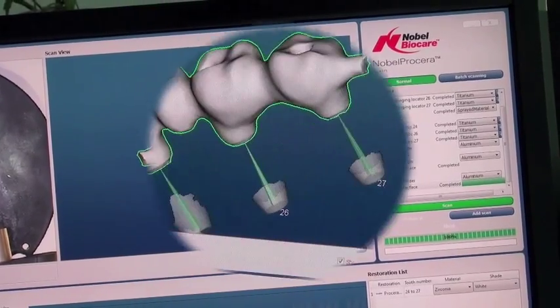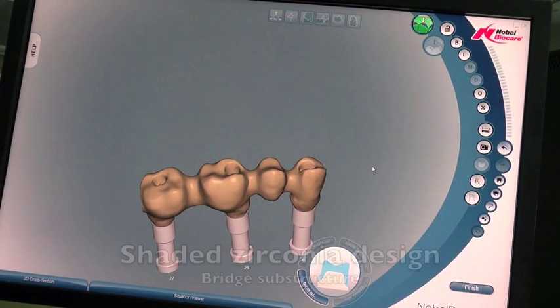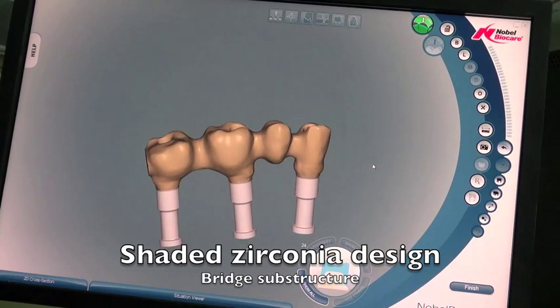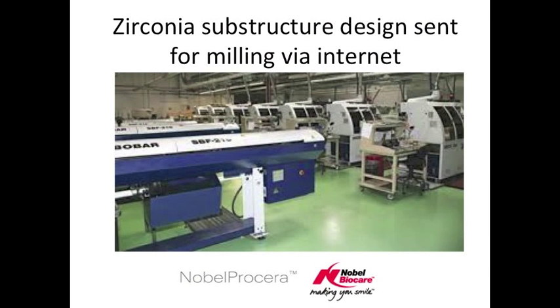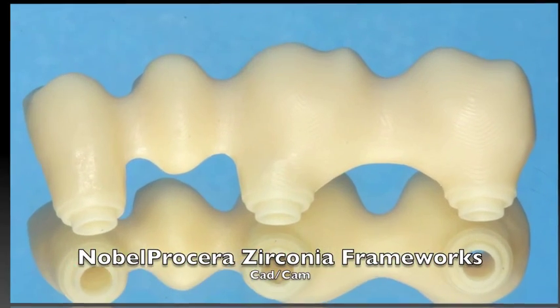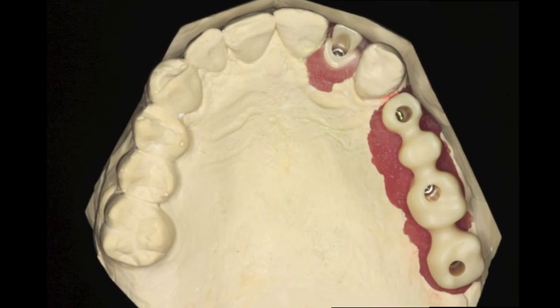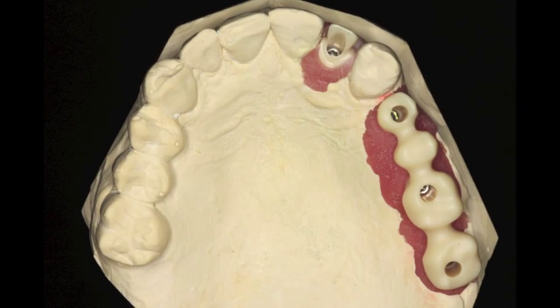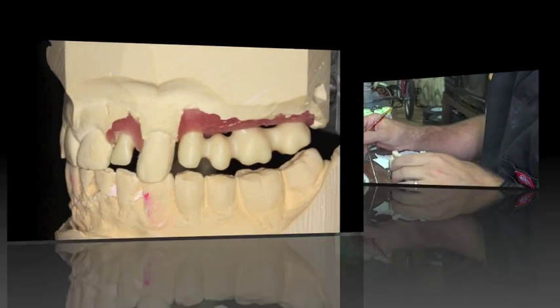We get a model on the computer and use it to create our milling structure. This is going to be made into zirconia and then the porcelain will be added on top. We send it over the internet to Nobel Biocare for milling, and they use their large CAD/CAM milling machines to make it. Later it's delivered back to the dental technician. You can see the before and after are quite similar — here's the beautiful shaded substructure, screw retained with non-engaging copings, fitting down on top of the model with space for the porcelain.